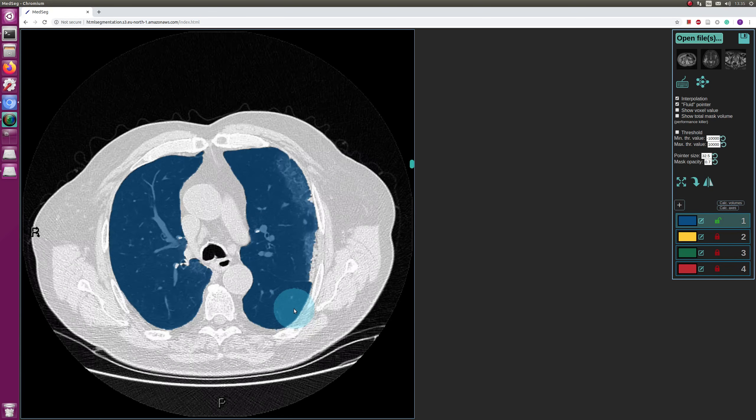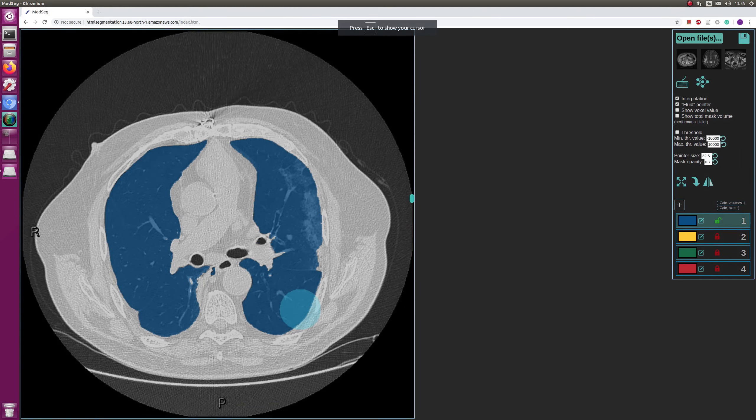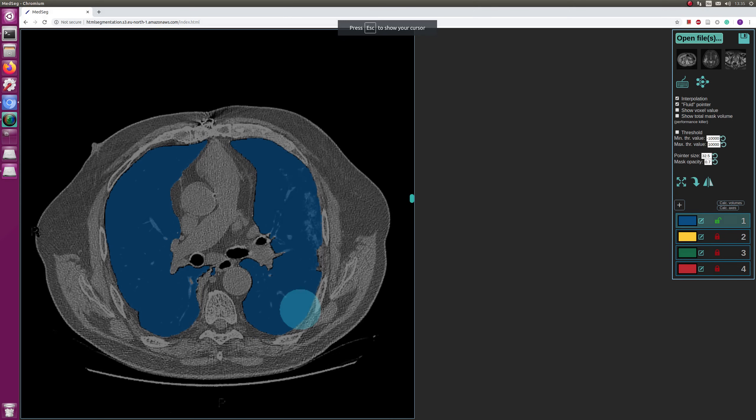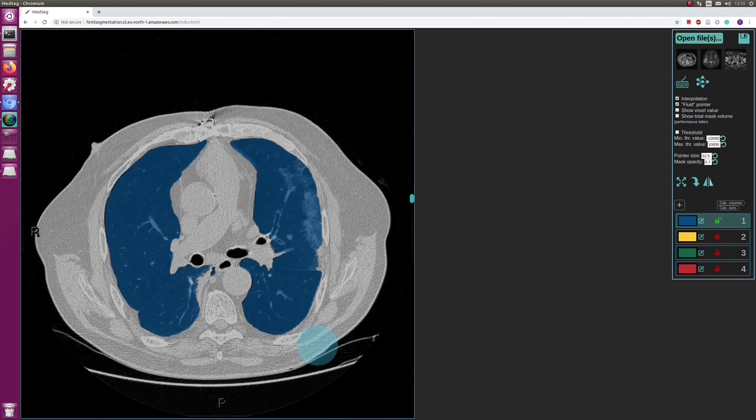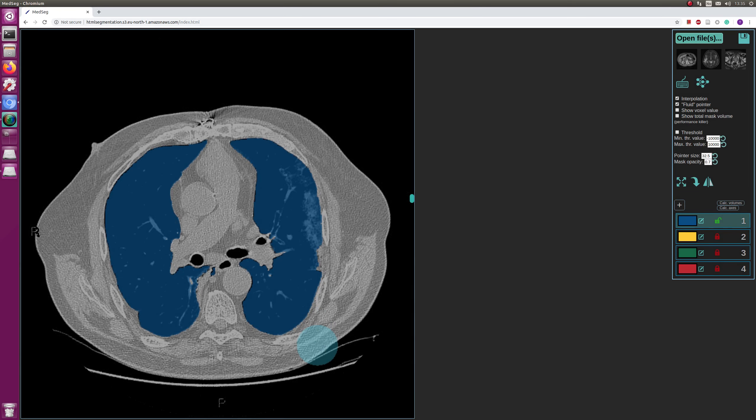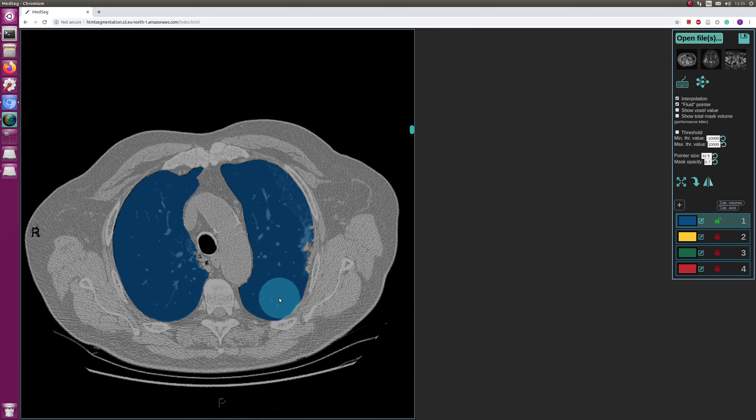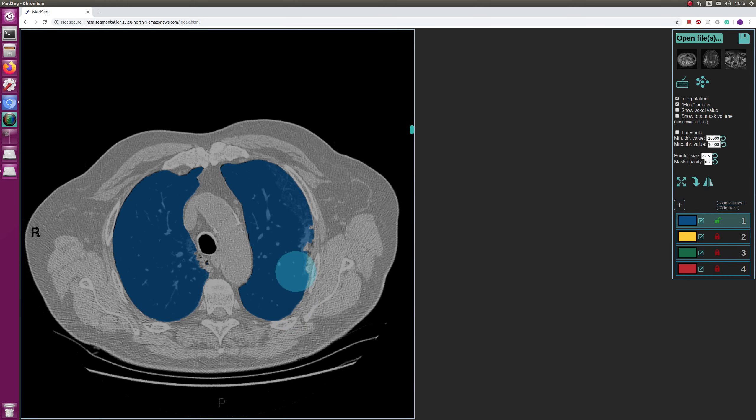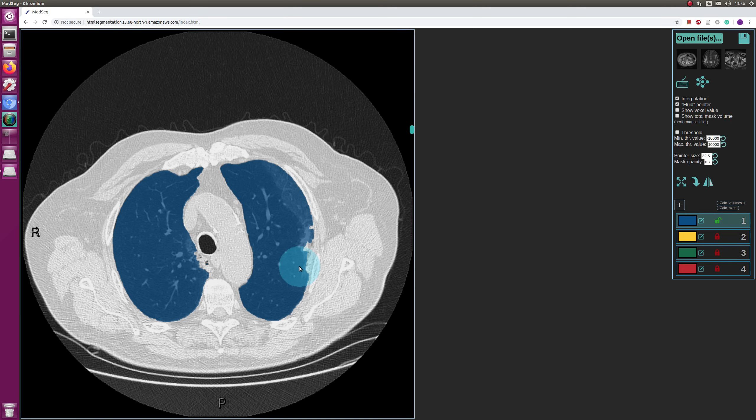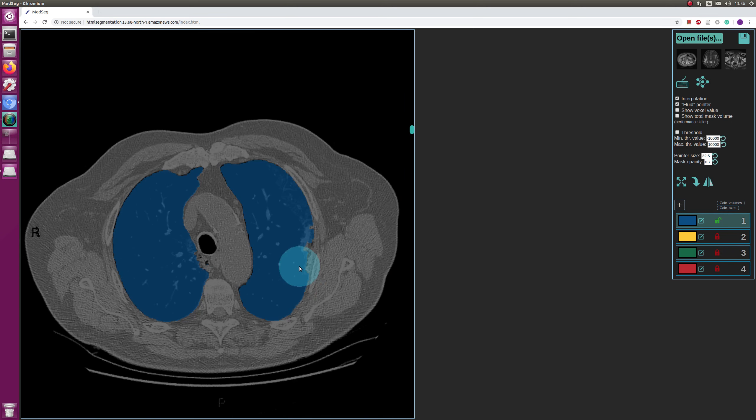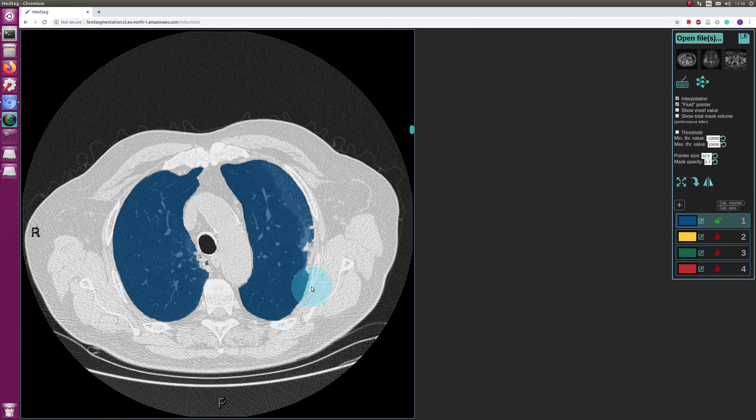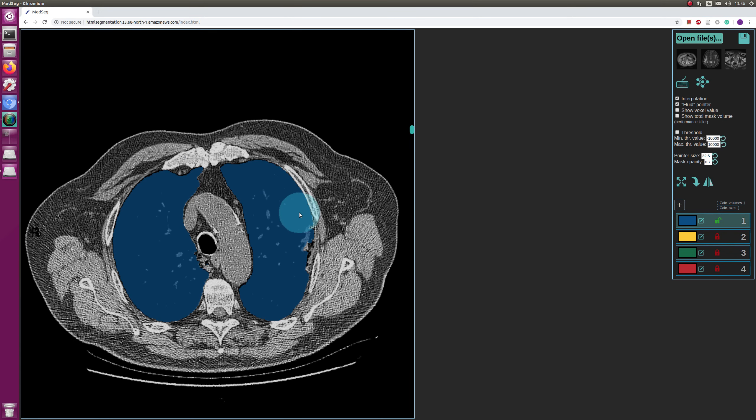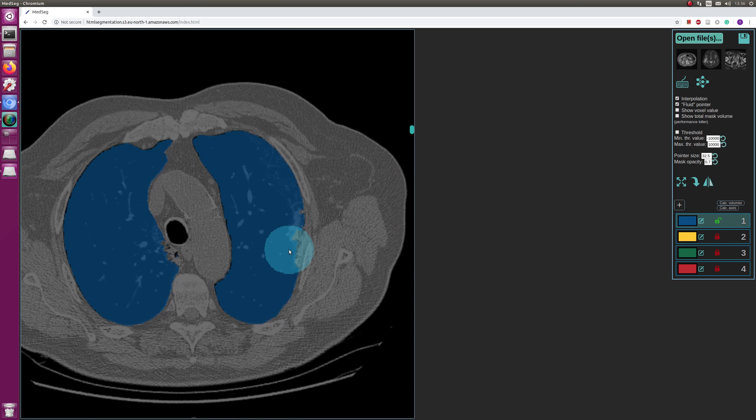So for correction, I of course changed the window leveling with the rest of the scroll wheel, or you can press the buttons three, four, five, six. For example, so this is the lung windowing and this is soft tissue windowing and this is bone windowing. I think bone windowing is quite okay.